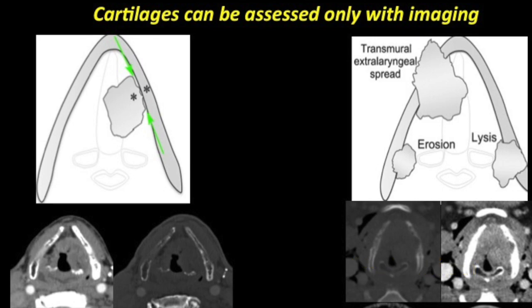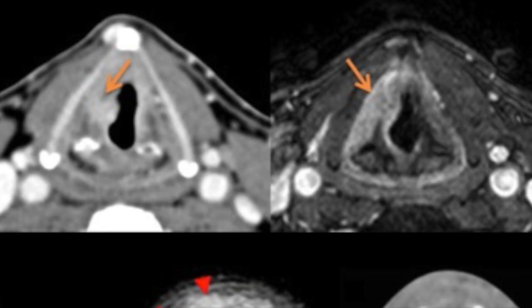MRI is a problem-solving tool in the management of laryngeal malignancies. In the first figure, the cartilage is not ossified and the white line of the thyroid cartilage is seen. There is an enhancing tumor on CT involving the paraglottic space, and MRI in this case shows that the cartilage is normal with only paraglottic space involvement — this is T3 disease.